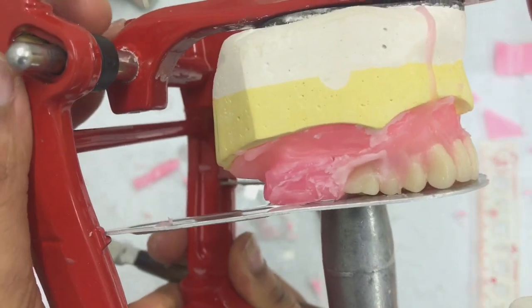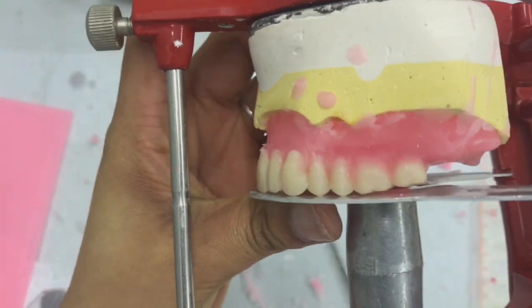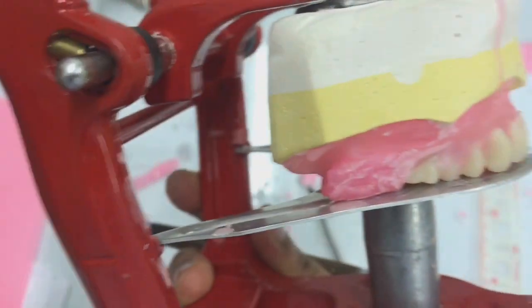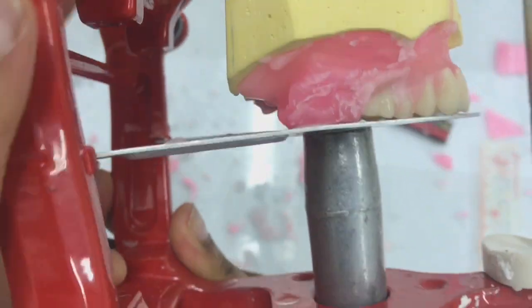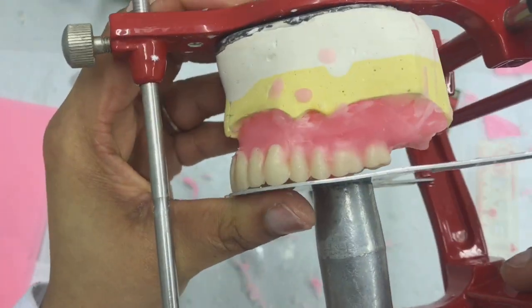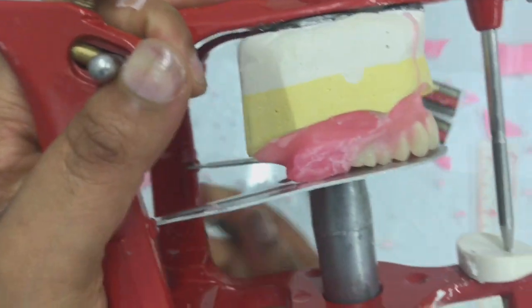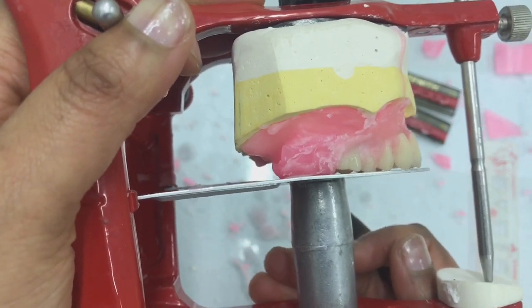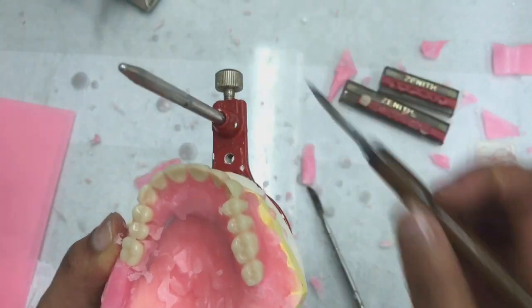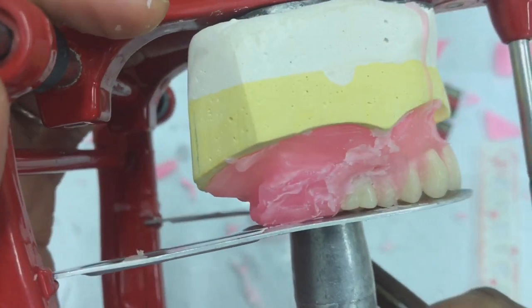Okay, so here's my curve of Spee on this side. And what you also need to ensure is that the steepness of your curve of Spee is exactly the same on either side. So you don't want a big difference between the inclination. So from what I'm seeing, this inclination is very mild compared to this one. So what I'm going to have to do is decrease the steepness of this tooth before moving on. That seems about fine now.